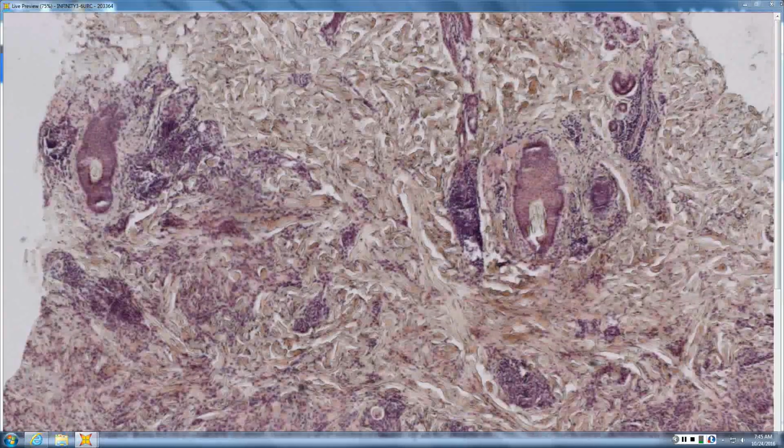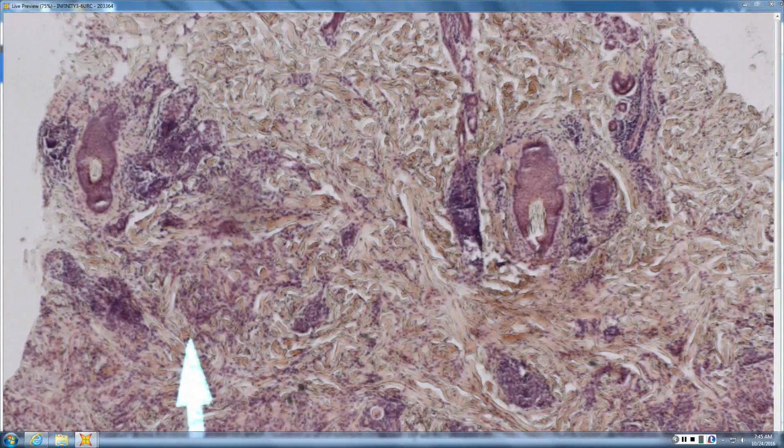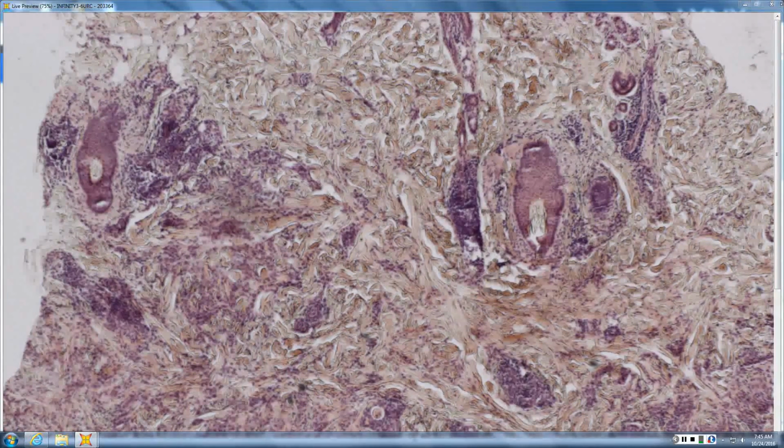Punch biopsy, we see collections of histiocytes up in the upper dermis. Are the histiocytes in round collections, long collections, interstitial around collagen bundles? Looks interstitial around collagen bundles. Okay, so you have interstitial granuloma.